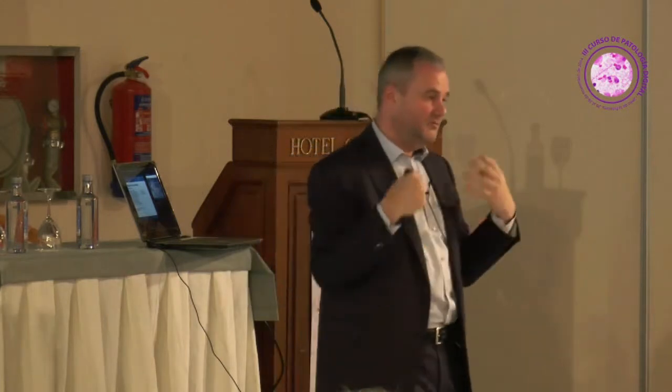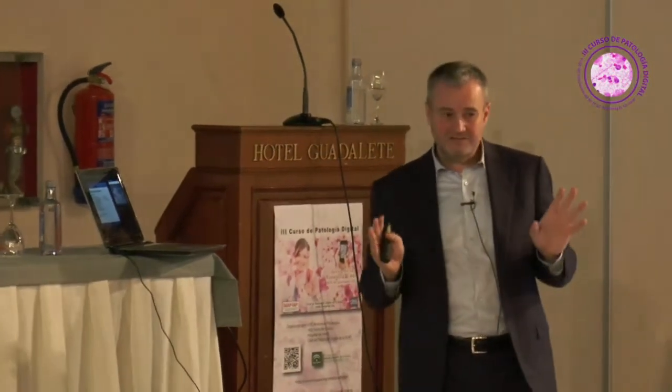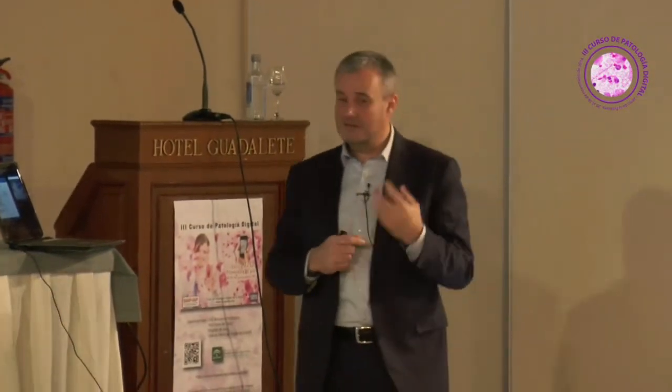This is case-based reviewing, so you're looking at all the markers at the same time, synchronized, and the results are there. They're shown on the slides, and you move to the next. This is what we're doing all over Denmark, and we have significant productivity increases because we can do workflow reassignment in the lab because of this automation. And this is all integrated with the LIS systems, either directly or via, for example, the Omnyx system.